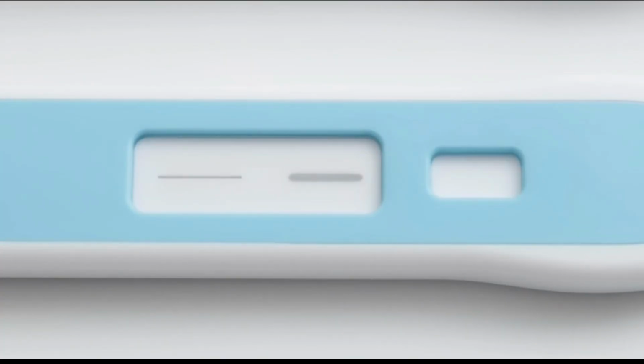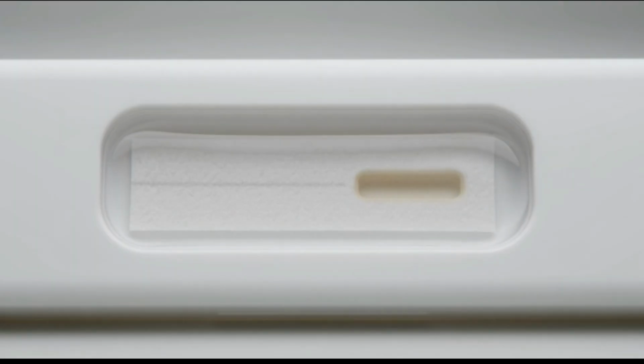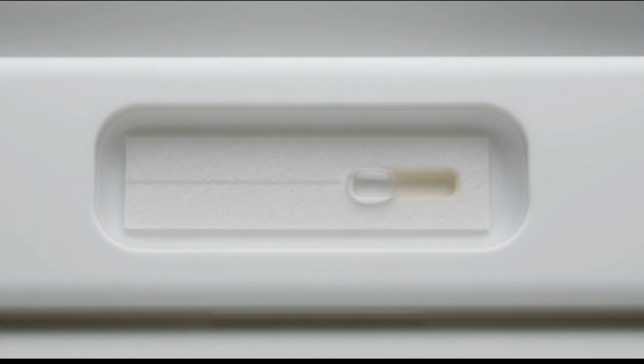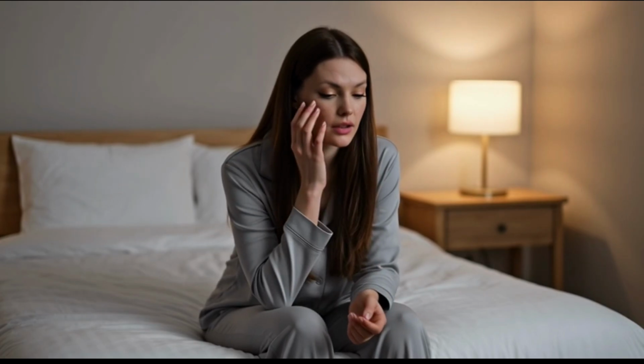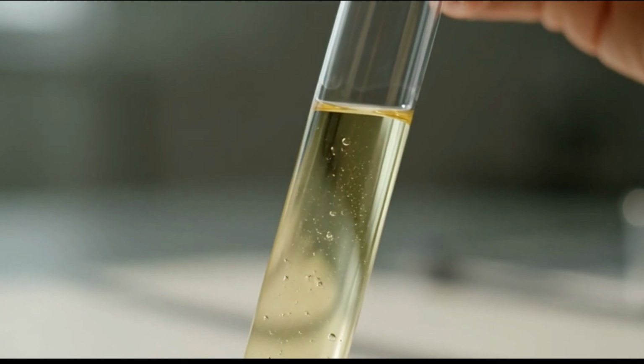An evaporation line is different. It appears when urine dries on the test strip. As the liquid evaporates, a faint, colorless line can remain where the test line would normally be. Doctors clarify that this is not caused by HCG. It's simply a chemical and physical drying effect.